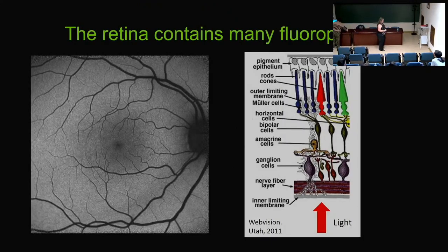So we wanted to tap into more fluorescence, and could we understand how the retina functions using fluorescence as a technique. And the reason that that's exciting is because traditionally, clinically, people look at retinal fluorescence. The image on the left is from a Heidelberg system, and it's an autofluorescence image, and it's really thought to come primarily from the lipofuscin.